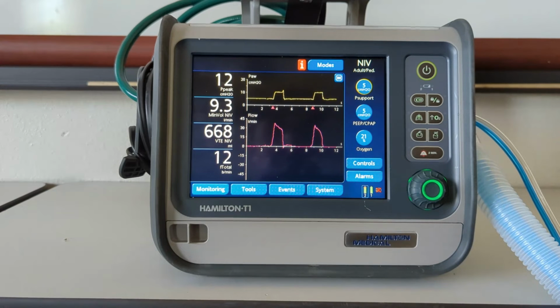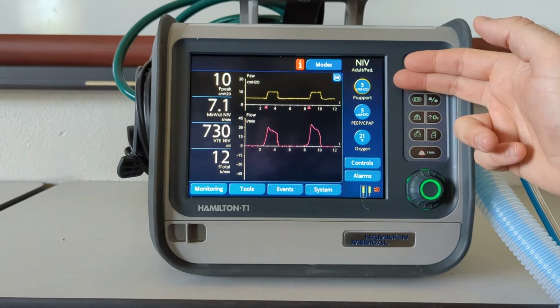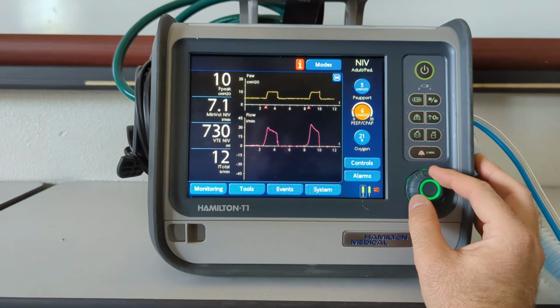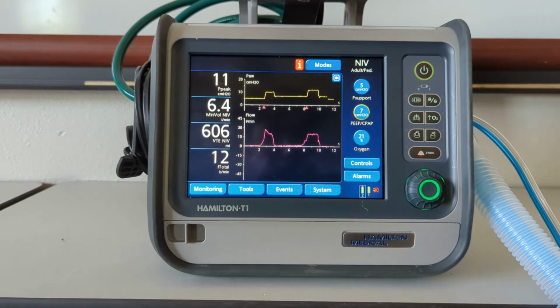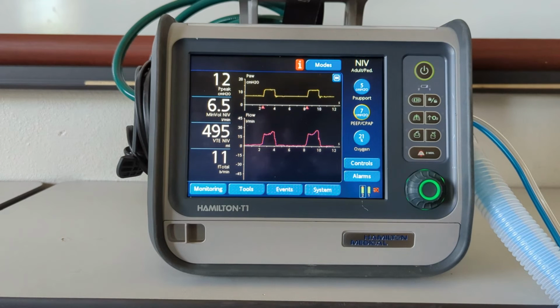We've reached our target tidal volume, but we still have an oxygen problem. So what we would do is leave the pressure support number alone and increase the PEEP by 2 at a time. Same rules apply for BiPAP as it does for ventilation. We're going to wait for equalization. So we make an adjustment of 2, so from 5 to 7 in this case, and we will wait until the SpO2 stops moving. So say it goes from 88 to 90%, then we'll make another adjustment.